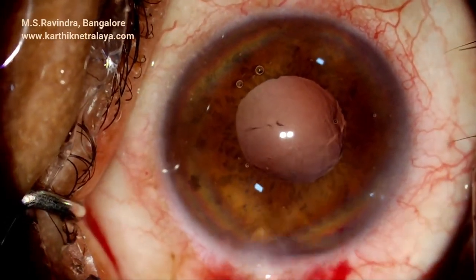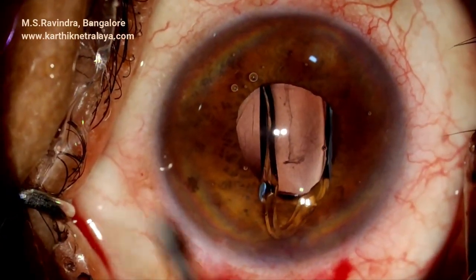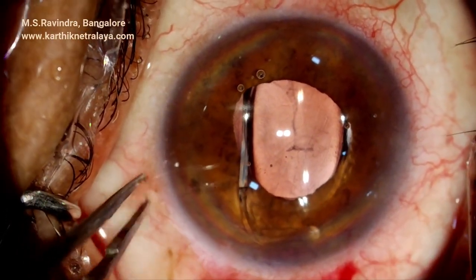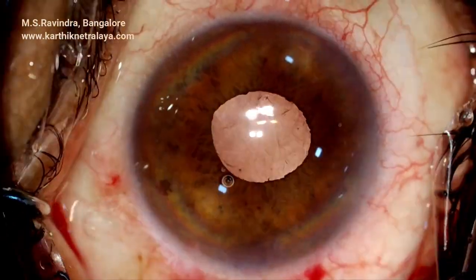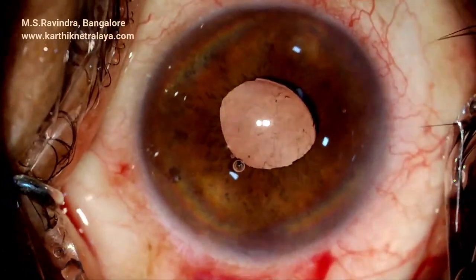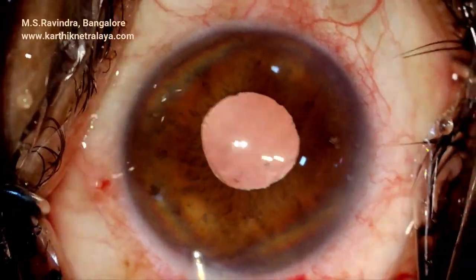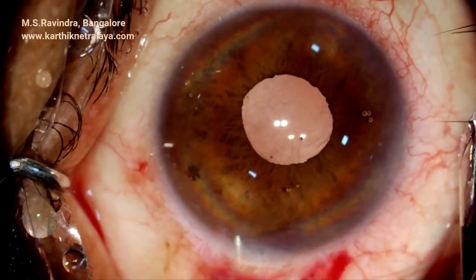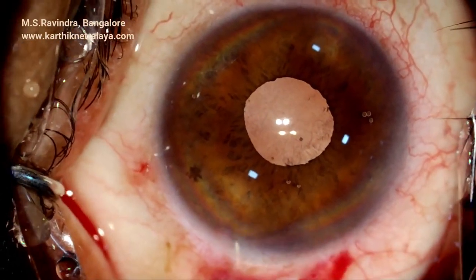This technique is very safe and maximally protective to the endothelium. The zonules are weak in such cases, and there is hardly any pull or push to the zonules in this technique, so zonular dehiscence is extremely rare. Inspection of the cortex in the periphery is very important to minimize post-operative inflammation. Post-operative rise in pressure is minimized by aspirating the entire viscoelastic from the capsular bag, from the angle region, from the endothelium, and from the anterior chamber.